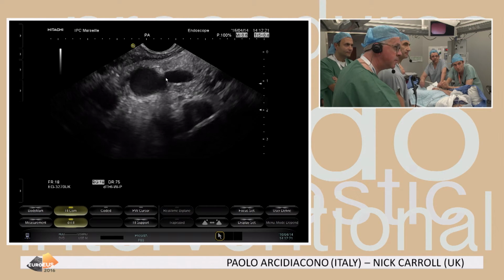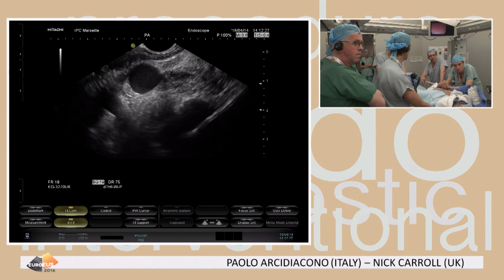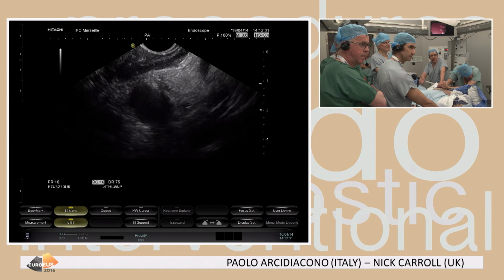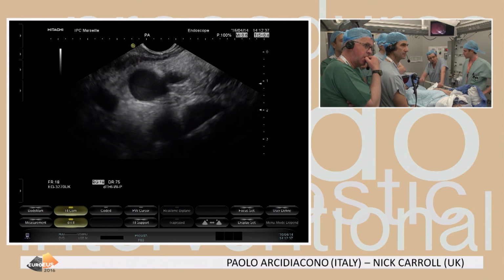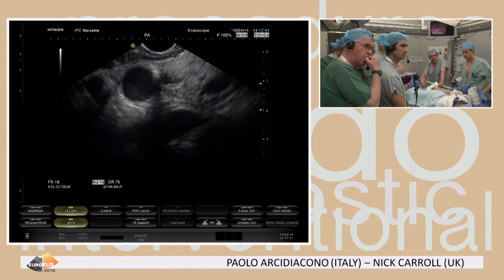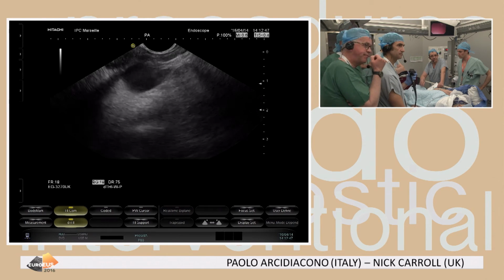So this is the first exam she's having after the surgery? This is the first US. She was followed by MRI. Because the MRIs were normal, and the MRI of March found this cystic lesion, but the MRI of 2015 was strictly normal. So it's a new lesion.